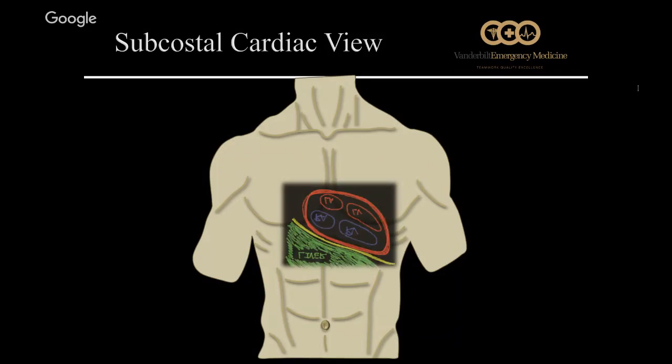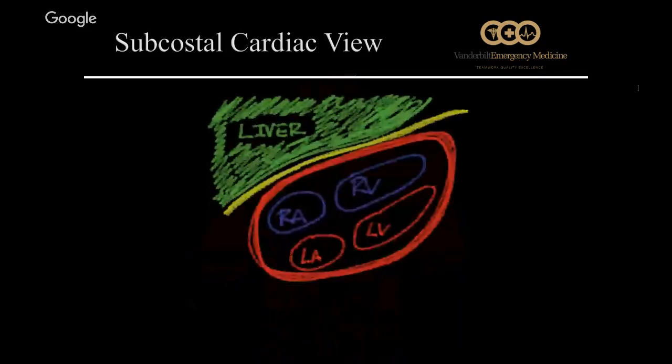So as the cartoon displays, we're going to actually be scanning through the liver first, and then we're going to scan the heart, and that's going to give us a view of the right ventricle, the right atrium, which will be closest to us, and then the left ventricle and left atrium will be further away. Next slide. All right, so here's what we're going to see. Next slide.